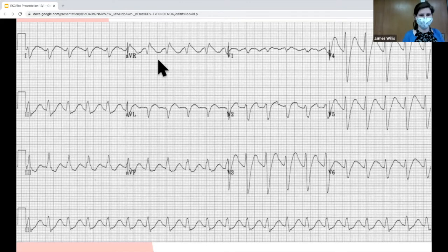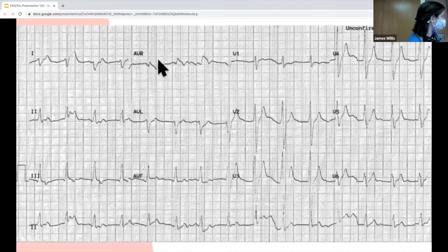All right, so this is just a really cool, unique EKG. This is a massive carbamazepine overdose. In massive doses, carbamazepine causes fast sodium channel blockade, and so they can have an EKG very similar to a TCA. The QRS widening tends to be more subtle, so they're closer to that 100, and they less commonly have the terminal R wave. So you have to have a high index of suspicion for this, but I just thought it was really interesting that it's a slightly different EKG, but still you'll see features of sodium channel blockade.